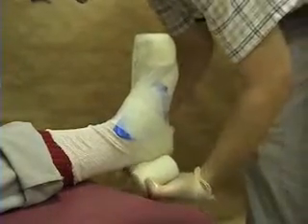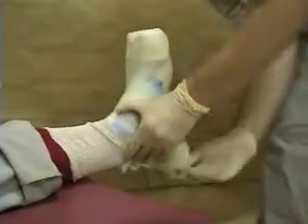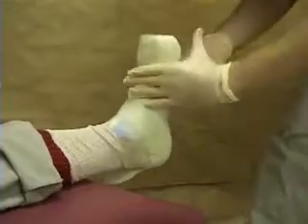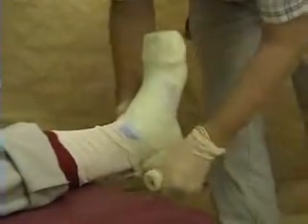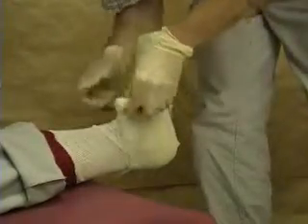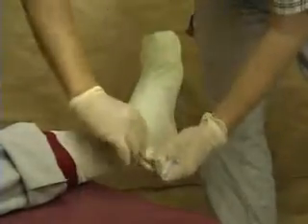Again, it depends on the size of the foot. It may be that you need 1.5 to 2 rolls of this material. I'm just going to overlap where those two rolls have joined. And just checking that we've got complete coverage here. There's an advantage in not having too much material on the top here, since that's where we're going to be making our cuts. It can be a little difficult to avoid sometimes. Okay, I'm just making sure that all the loose ends are pulled down snugly at the end. Okay, we've come to the end.